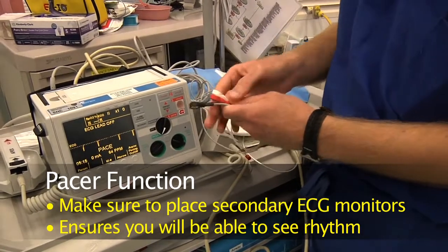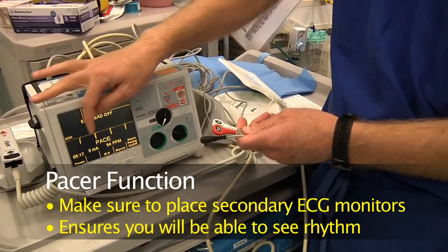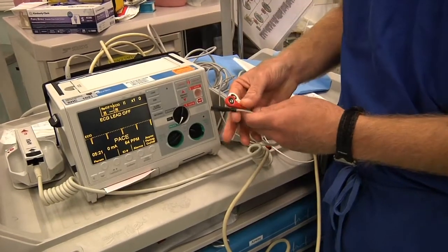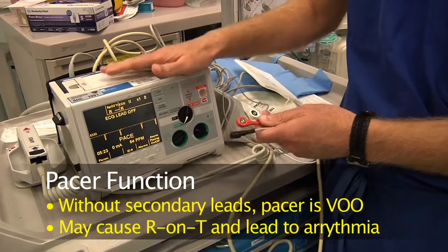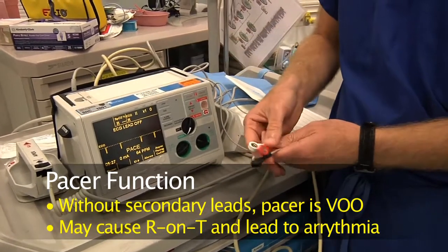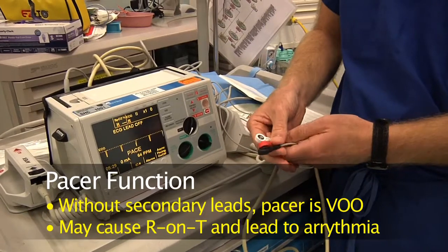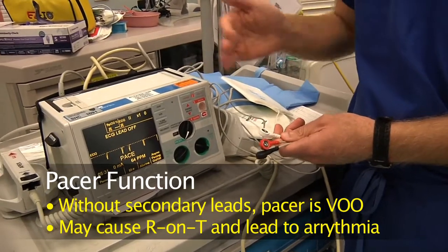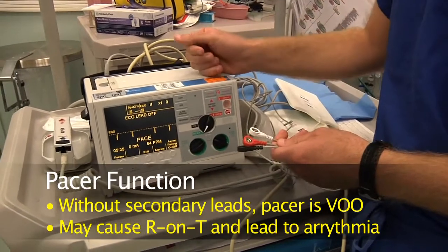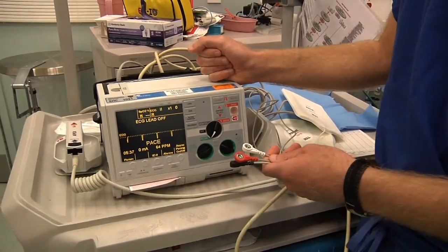So you need to put these on to be able to see what you're getting, if you're getting capture. And then secondary, without these on, this pacer is a VOO, meaning it's just going to pace no matter what. If you hook these in, then it can actually inhibit. And that's important because if the patient has a competing rhythm, if you don't have the inhibition ability, you can have an R-on-T and cause a ventricular dysrhythmia.